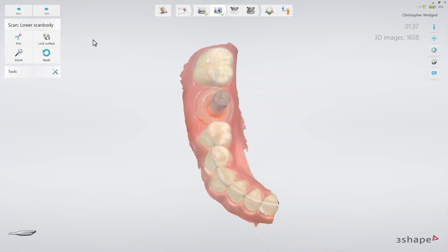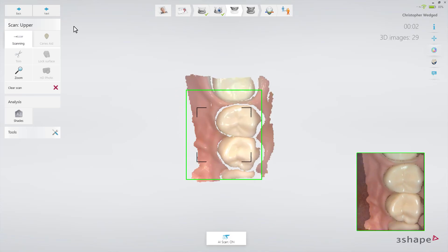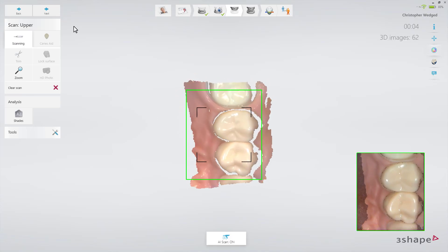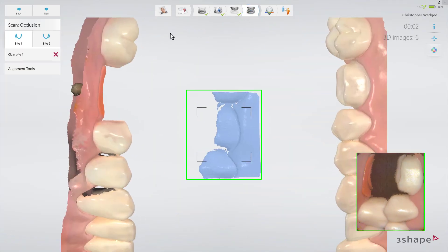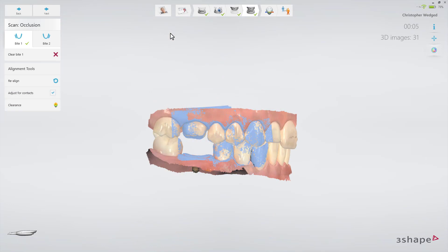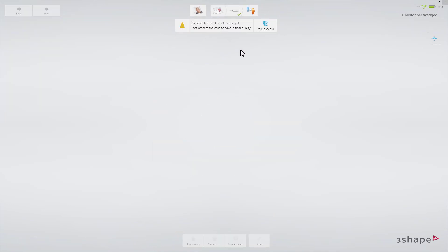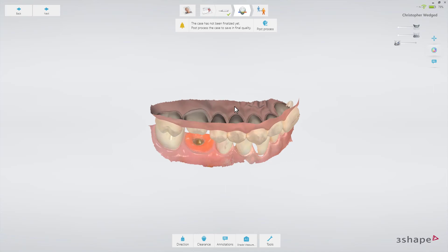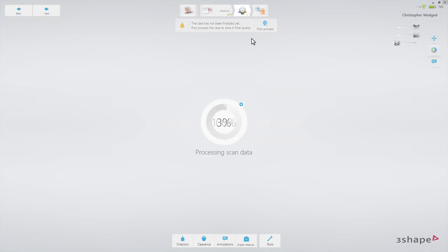When the Scan Body scan is complete, remove the Scan Body. Click Next to scan the upper arch as our antagonist, following the official scan strategy. When the upper arch is scanned, move to the Bite. Switch to the Analyze page to confirm that there is enough space for the reconstruction between the upper and lower arch, and optionally add some comments or shade measurements.